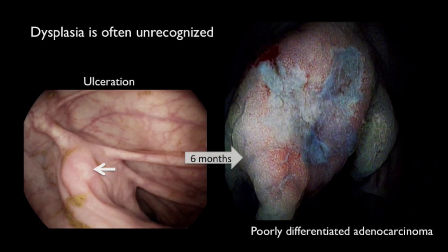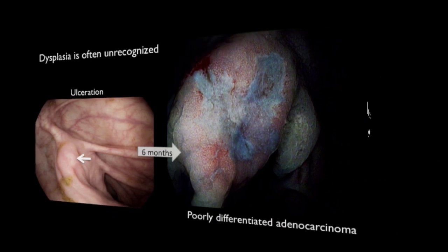In this patient with Crohn's colitis, colonoscopy revealed a small isolated ulceration. Biopsy was taken showing low-grade dysplasia. Subsequent pancolonic chromoendoscopy was performed showing a non-polypoid superficial elevated neoplasm with ulceration. Chromoendoscopy with targeted biopsy revealed a poorly differentiated adenocarcinoma.